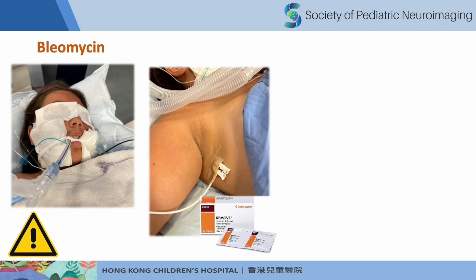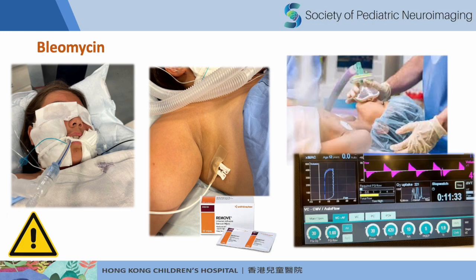We put the ECG leads under the axilla so that when they wear swimsuits, it's still sort of hidden, and it's not in an obvious spot. And we would use Remove gently to remove all the adhesive associated. And it's important to communicate with the anesthetist.